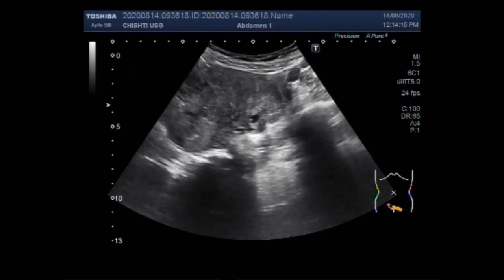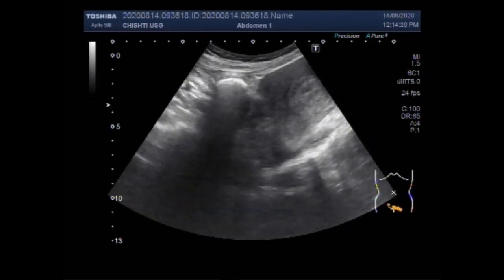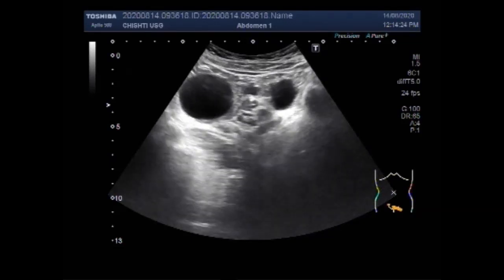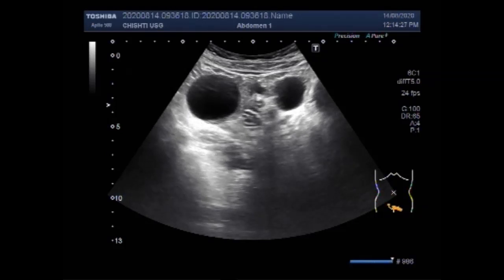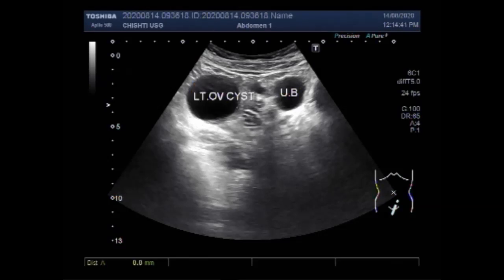Now you are also going to see the uterus. Endometrial hyperplasia is a histological diagnosis often made after sampling an endometrium that appears thickened on pelvic ultrasound. This is the urinary bladder and this is the left ovarian cyst. Endometrial hyperplasia is defined as irregular proliferation of endometrial glands with an increased ratio of gland to stroma.